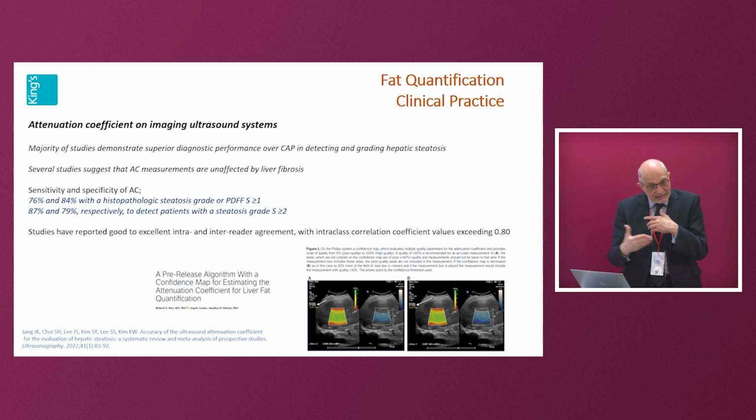Because the deeper it goes, and the same with the fat, the deeper you go, the less accurate. Of course, that's going to be. Your attenuation measurement is going to change considerably through a very fatty liver all the way down. So you're getting less and less signal to noise ratio, and your measurements become inaccurate. So it has the same thing.